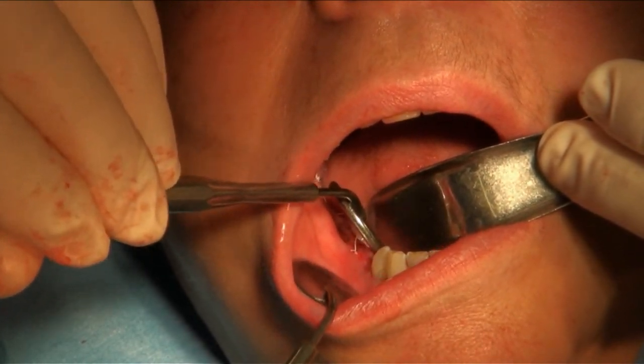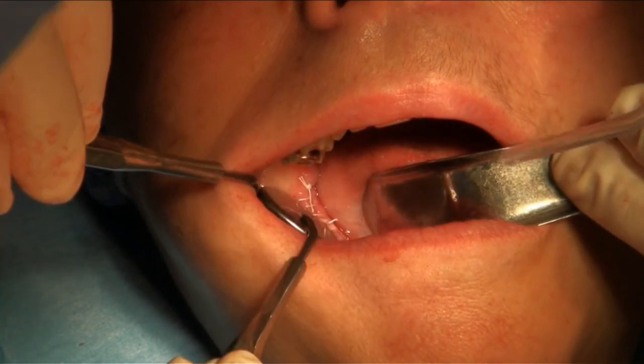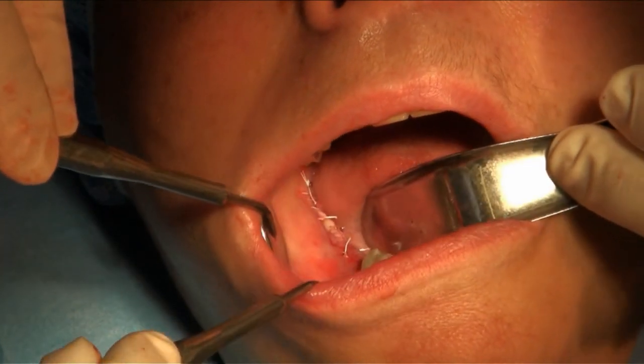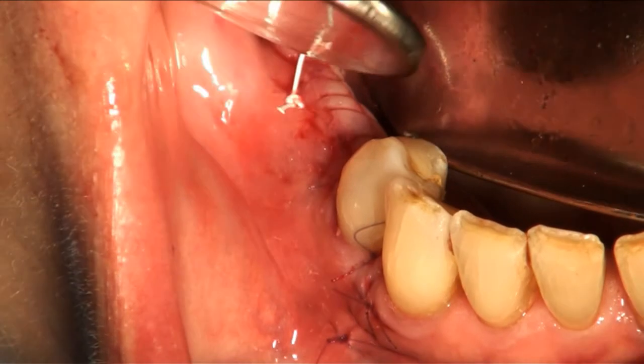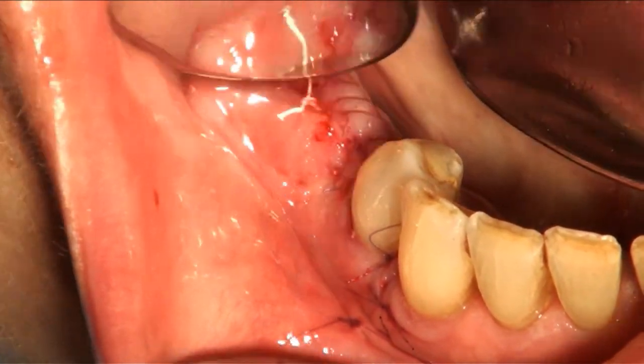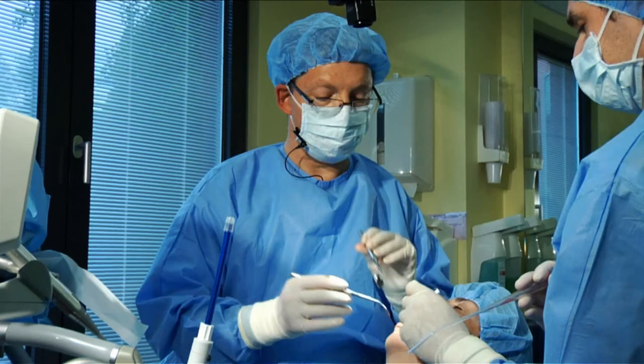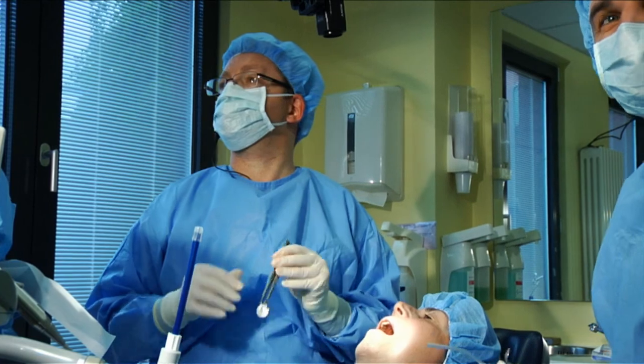It's really easy and without any tension on both sides, either in the posterior or in the anterior part of this surgical area. Well, thank you very much. That's it.